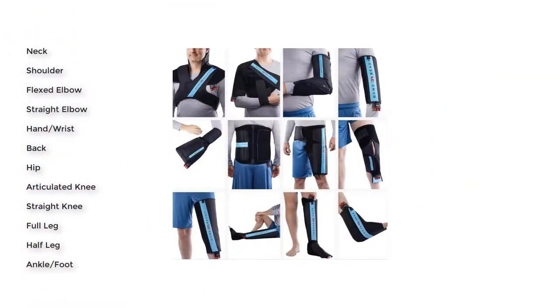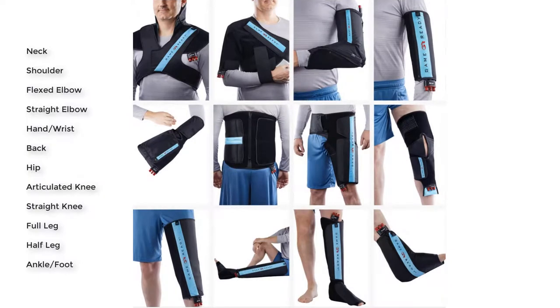These are the different types of wraps, so you can have an idea of how to put it on.